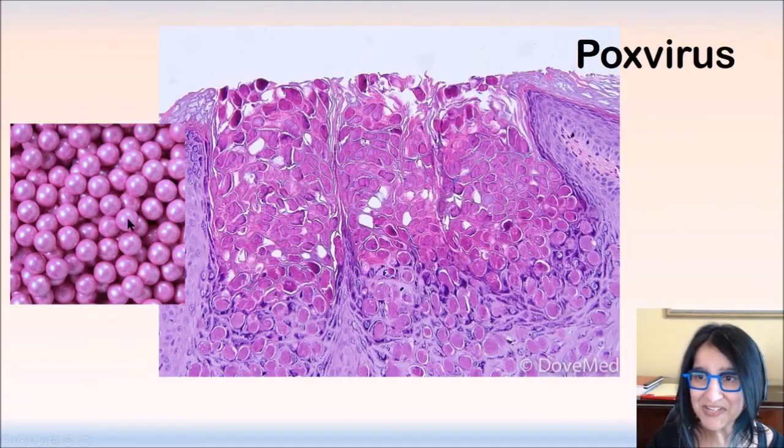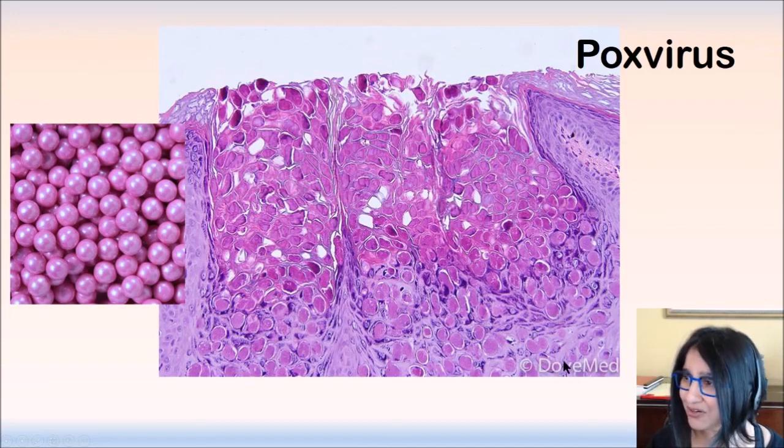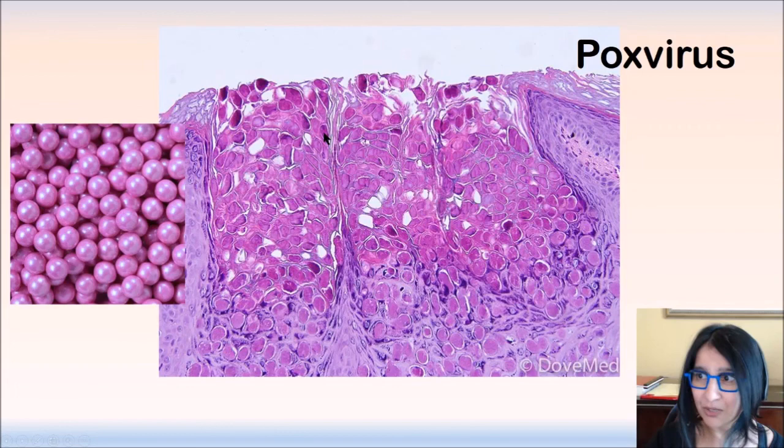In this first image, I kind of showed this. These are actually sixlets. I'm not trying to ruin sixlets for you, but these little balls of pink just fill up these cups. And of course, they're starting down here in the keratinocytes and moving their way upwards. But it almost looks to me like there was a cup here and someone just filled it up with little pink balls. And to be honest, I just think it's a very pretty image.